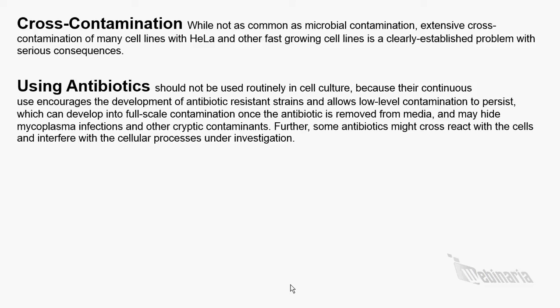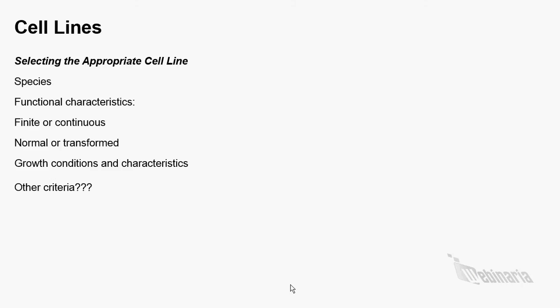Antibiotics should only be used as a last resort and only for short-term applications, and they should be removed from the culture as soon as possible. If they are used in the long term, an antibiotic-free culture should be maintained in parallel as a control for cryptic infections. Okay. Cell lines.